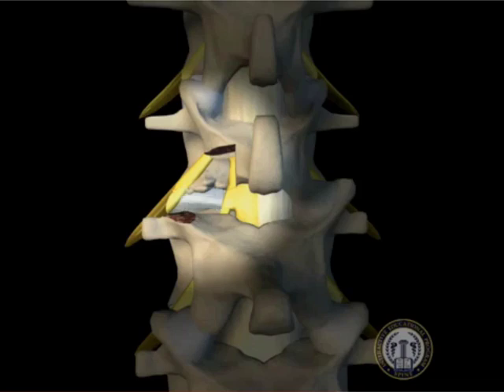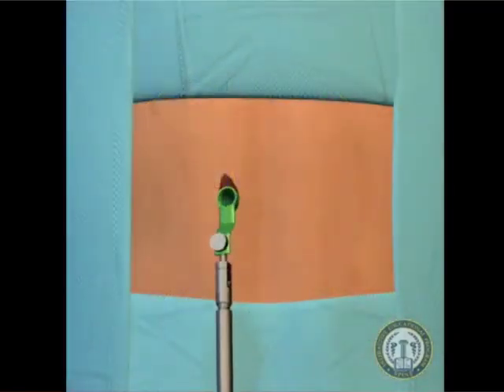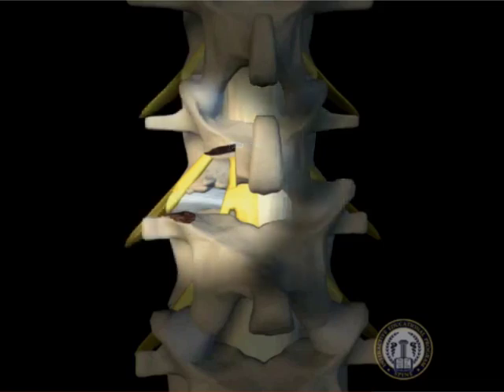At this point in the procedure, if the patient has symptomatic central stenosis, the tubular retractor may be angled to perform a more medial laminotomy. If necessary, bilateral decompression can be achieved in this fashion through undercutting the spinous process and drilling away the contralateral lamina. Frequently, posterior osteophytes will need to be removed to optimize access for the discectomy.